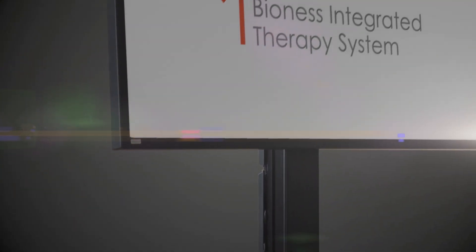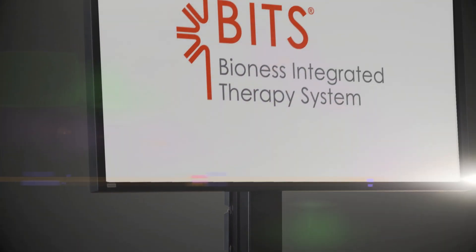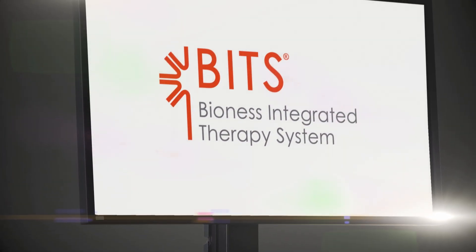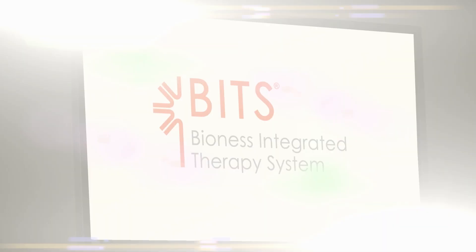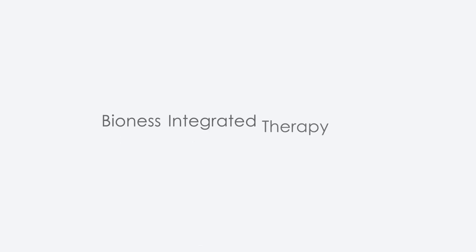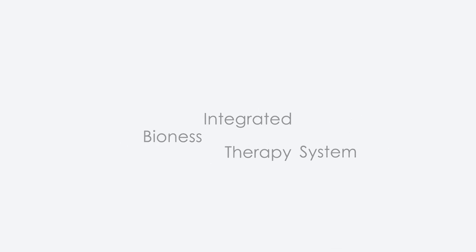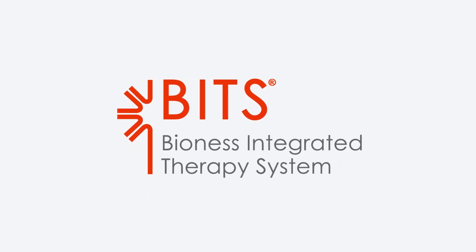The Bioness Integrated Therapy System, or BITS, is Rehab's most advanced multidisciplinary software-based solution.